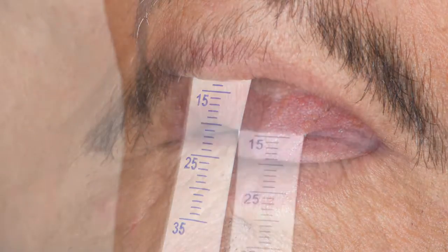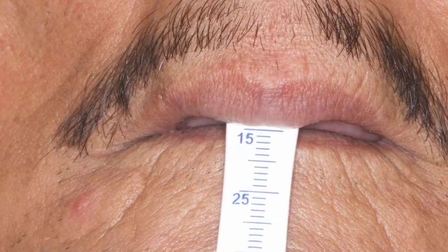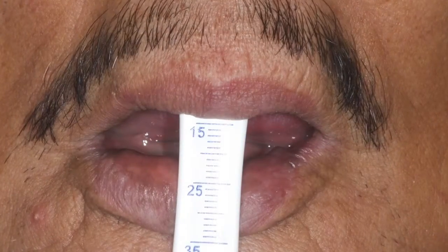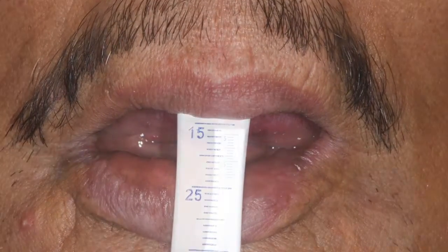Measurements may slightly vary from clinician to clinician. In many offices, various clinical staff members are asked to make this same measurement. The numbers are compared and a consensus determined. Then, ask the patient to smile. Record the distance from the incisive papilla to the shortened edge of the upper lip. This measurement gives the AvaDent technicians some sense of tooth exposure when the lips are animated.